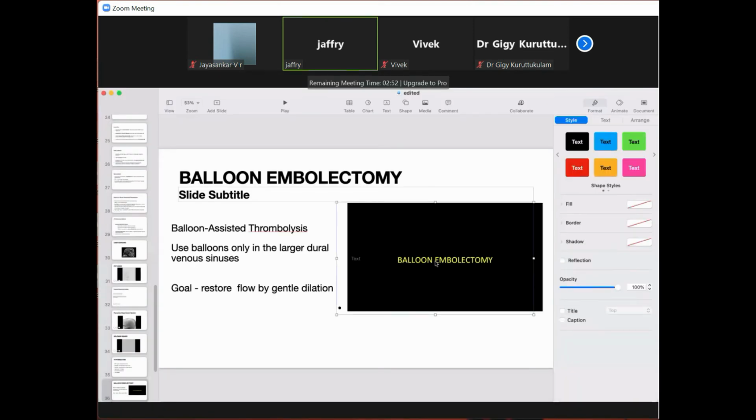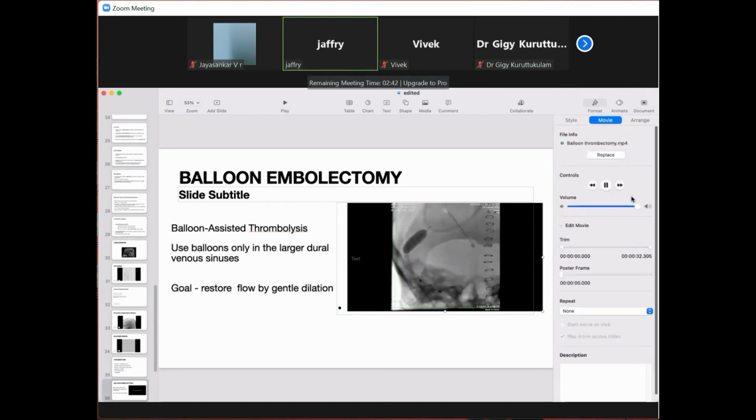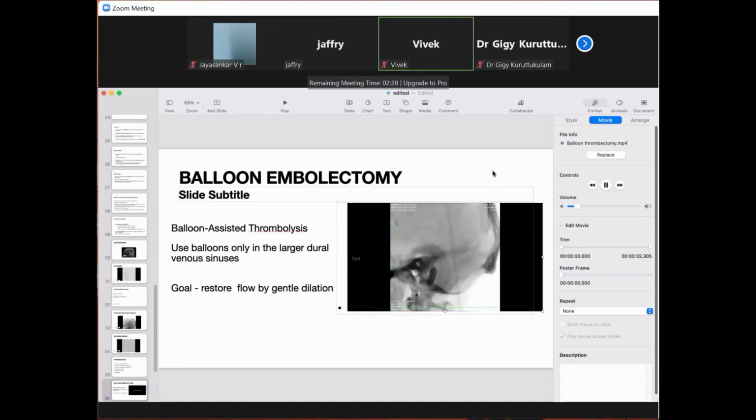This is one video about balloon assisted thrombolysis. Here in this video, this is the process in which we use a large 6 to 8 millimeter balloon. Is it visible? Okay, thank you, sir.